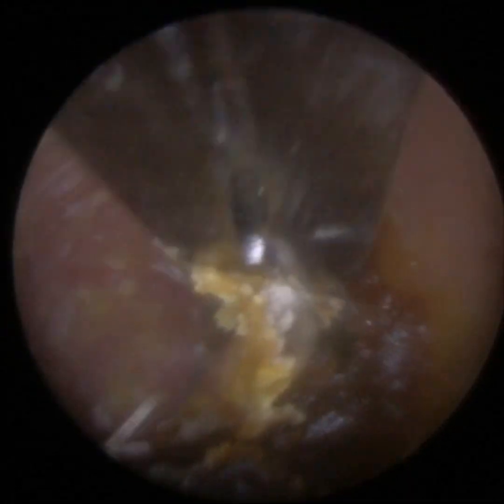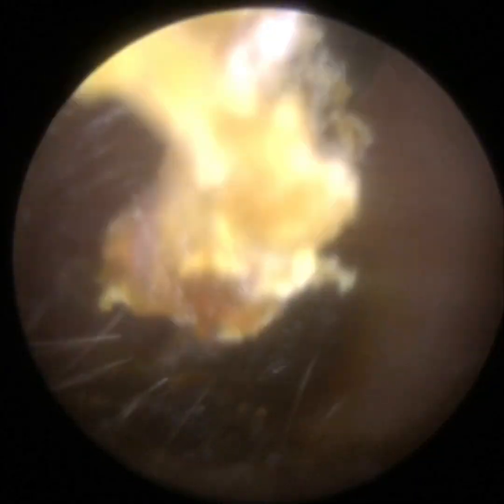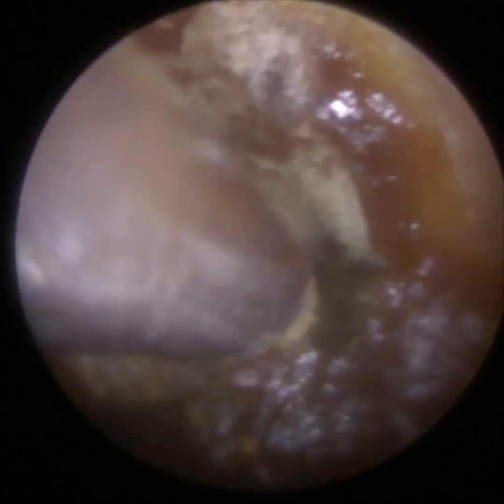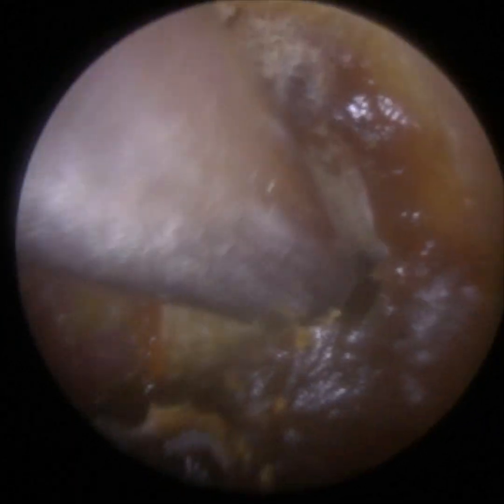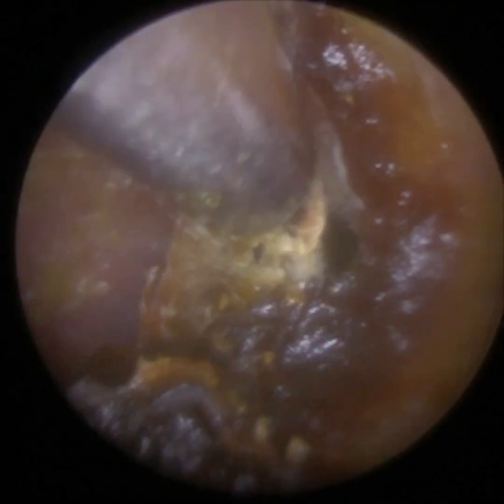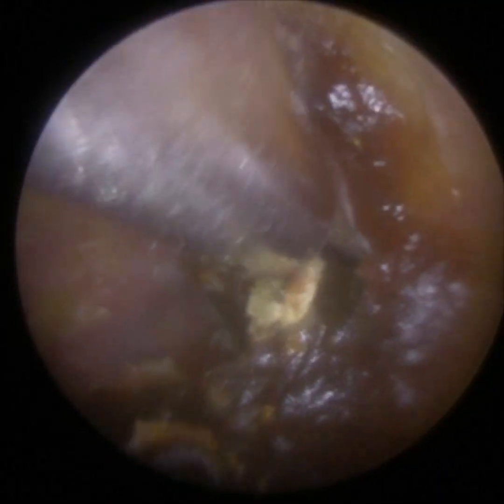But it's not much more we could have done. You can see we avoided the canal wall. This does need to come out, unfortunately, and the patient was aware of that and was happy for me to continue. So I got some out, and I'm just, again, manoeuvring this dead crusted skin a bit. So I think I'll go back in jaws again with the forceps. I think I got a lot more out this time.